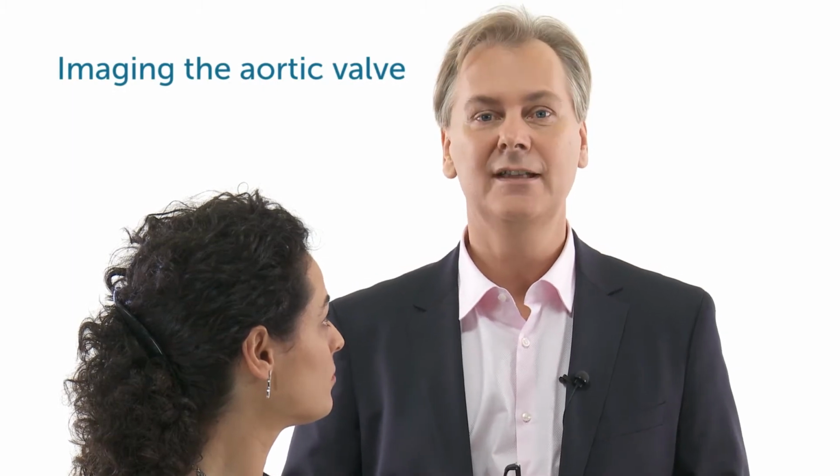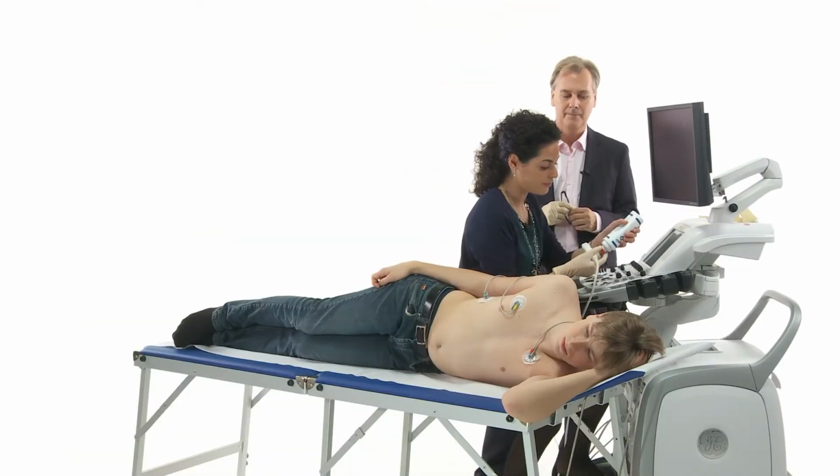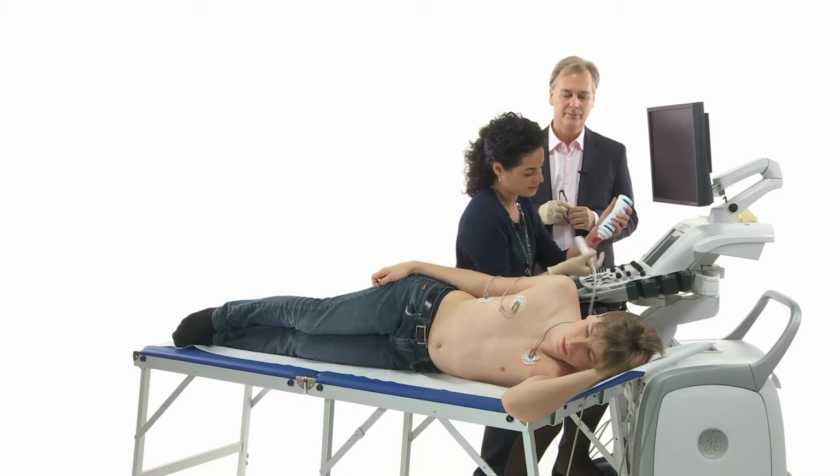You just saw some fascinating video images of the aortic valve. But in echocardiography, we see them a little bit differently because it's a cut plane technique, and we can get numerous different cut planes. The first one we want to show you is the so-called parasternal long axis view. Exactly, Thomas. We can really have a nice image of the aortic valve.